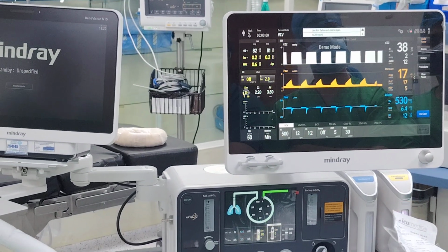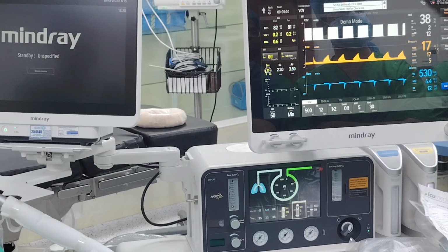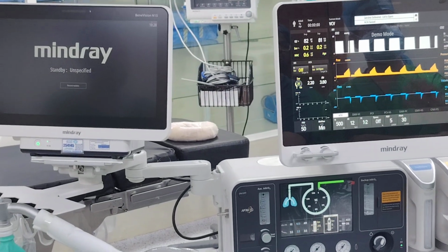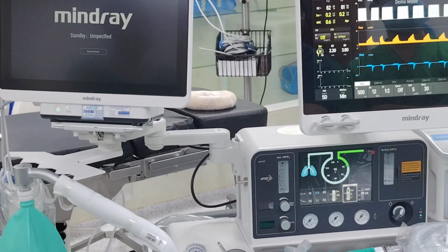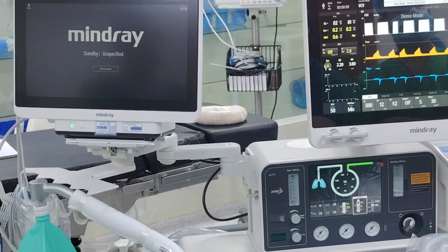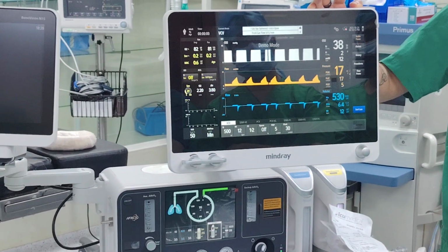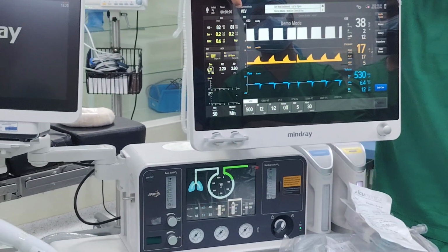Like today, I'm driving 20 kilometers, but I put cruise control at 100. What happens to the car? It's going to press the gas to reach it as fast as possible. What you usually do manually is increase the flow. The machine will do it for you. Once it reaches 2, what happens? It will slow down, it eases off the gas. I will maintain 2. What happens later on?